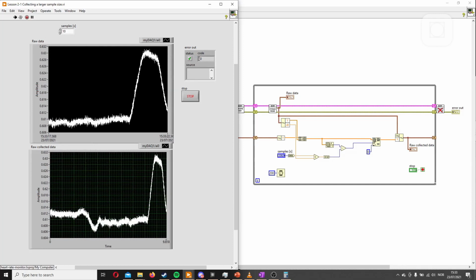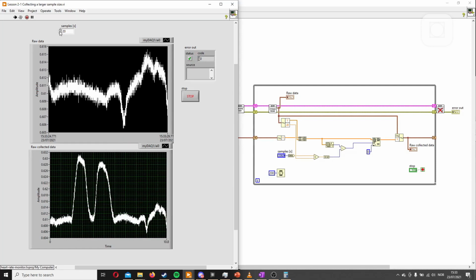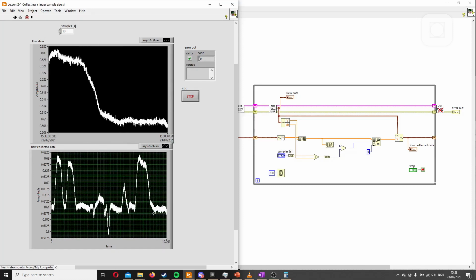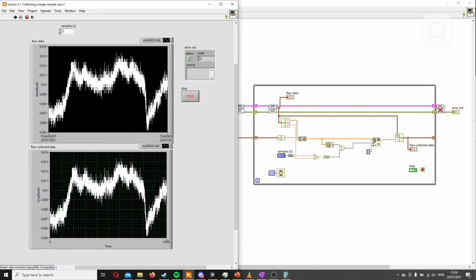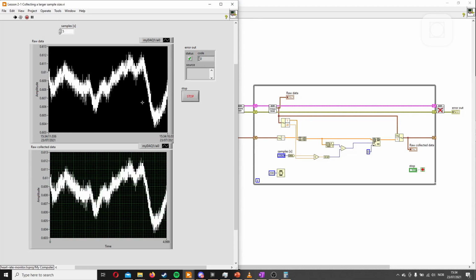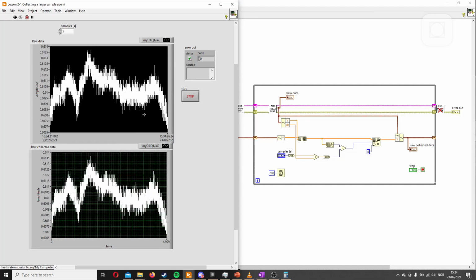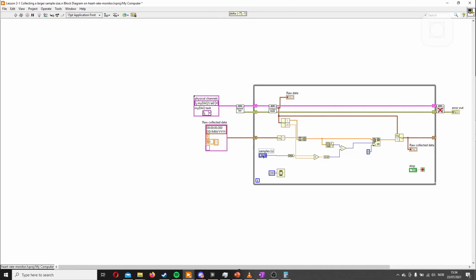But as you can see here, now we're collecting as much time as we want to. So let's say we want 20 seconds, and it collects more data. You see here, it just moves from one data point to another, and then here it goes to 20 seconds. And if we shorten it down, say press 5 seconds, it will automatically delete all the old data and keep the new one. This graph only shows the data we have stored, unlike the chart, which stores the data for us. We would need a way to gather data outside of the chart if we want to collect it, but there's also a limit amount of how much data it can collect, so this would be a much harder way to do it. So let's stop it and then compartmentalize this into a sub-VI.